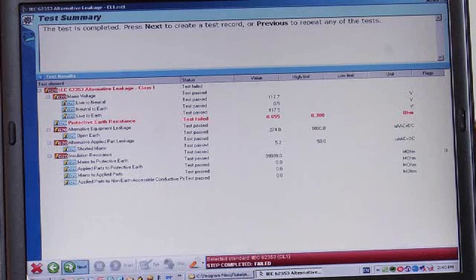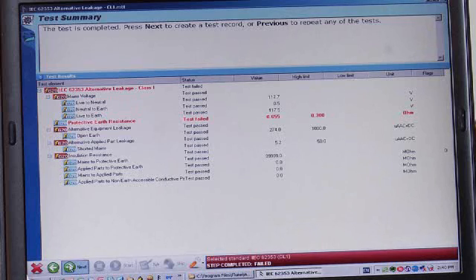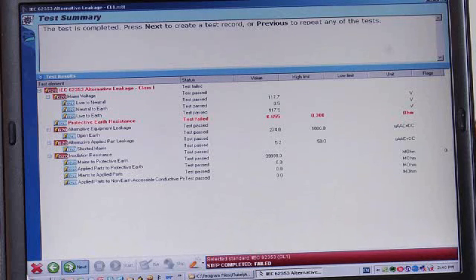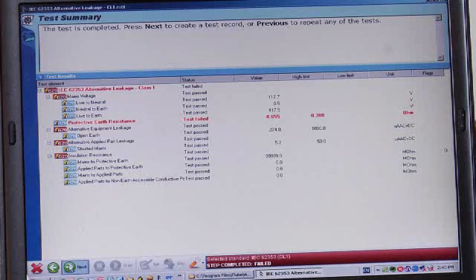At this point, we could use the previous button to go back and repeat the electrical safety test in total if we thought we could do something to correct the high resistance to ground. Otherwise, this medical device will have a failed test procedure and will be in the repair queue for corrective action.